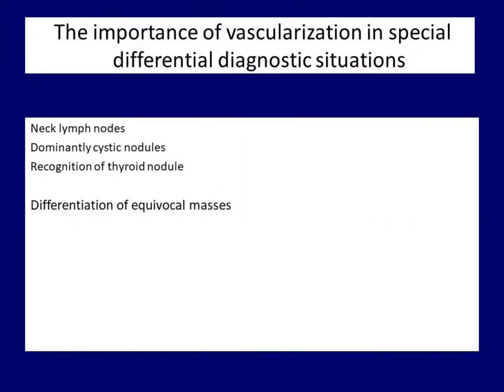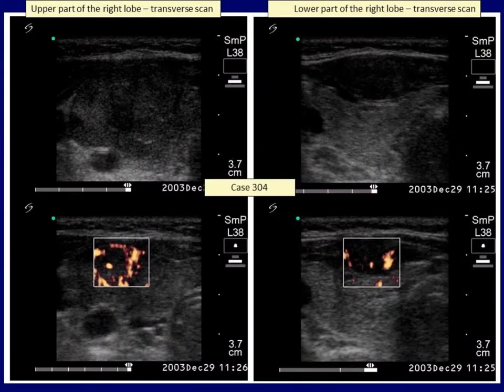In everyday practice there can be many individual cases for which no rule can be made. In this patient, there was a papillary cancer in front of the thyroid gland which could not be separated from the muscle in grayscale mode, but was detected by vascularization. A muscle fiber is usually avascular and never presents such increased flow as could be observed in this case.